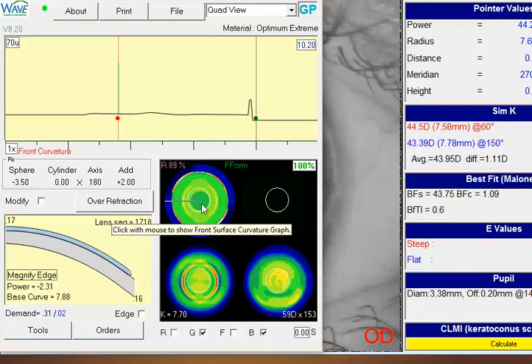And so you'd expect the smaller pupil to keep you in the middle there. So that would suggest that although the lenses sound like they're fitting quite well overall, they may not be centering quite as perfectly as you'd like, or you might have a slightly displaced visual axis or something along those lines. So what I'd recommend is really trying to get that pupil size a little larger, and that should help out with that. As far as the overall design, it sounds like it's working quite well.